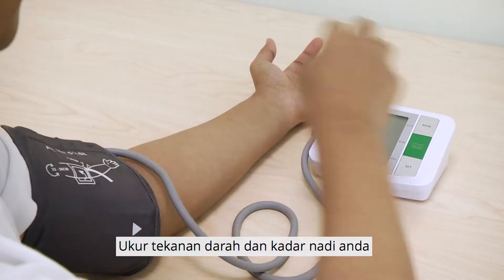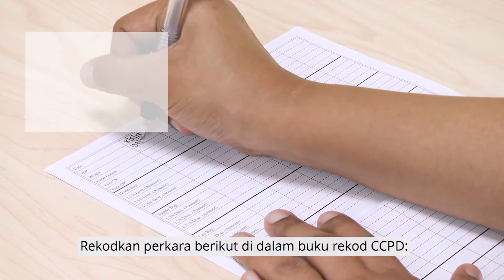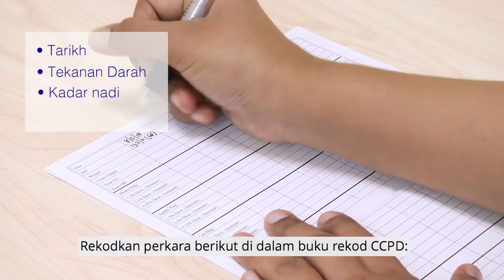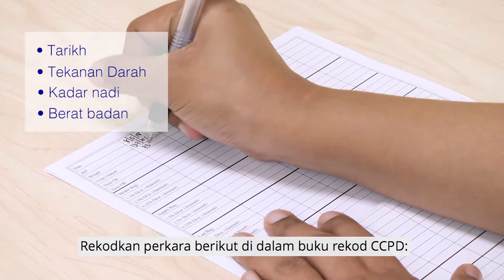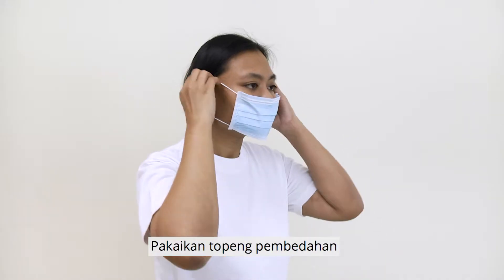Measure your blood pressure and pulse rate. Record the date, blood pressure, pulse rate, and weight in the CCPD Record Book. Put on a surgical mask.